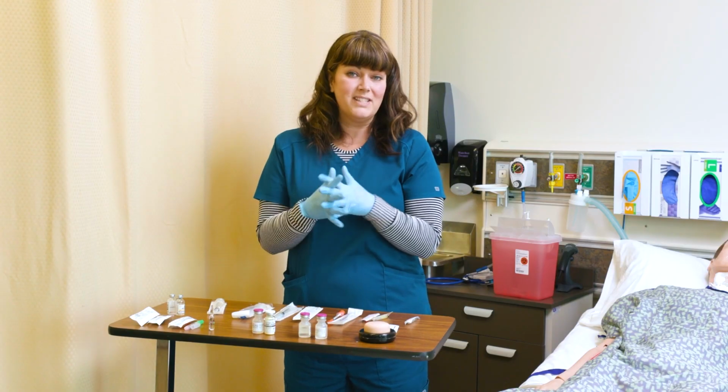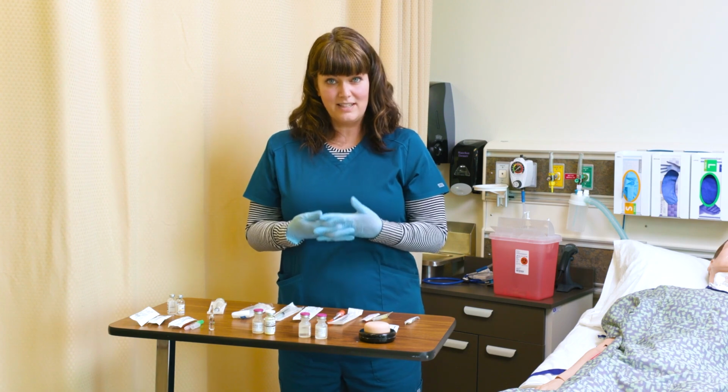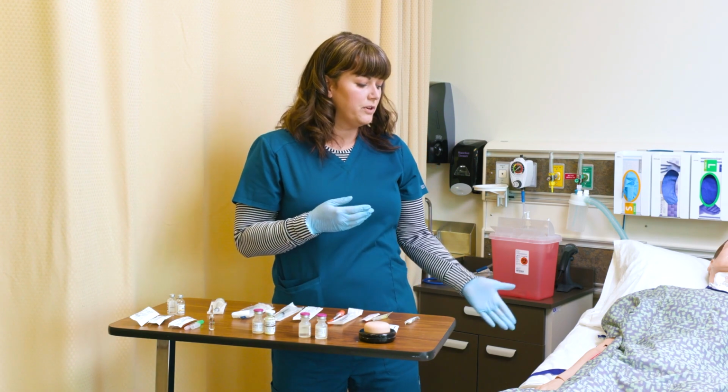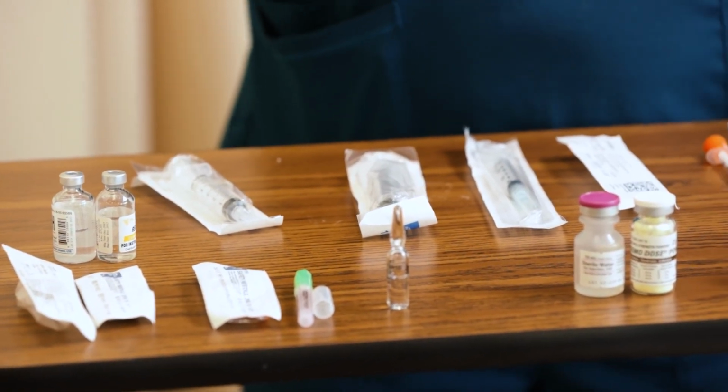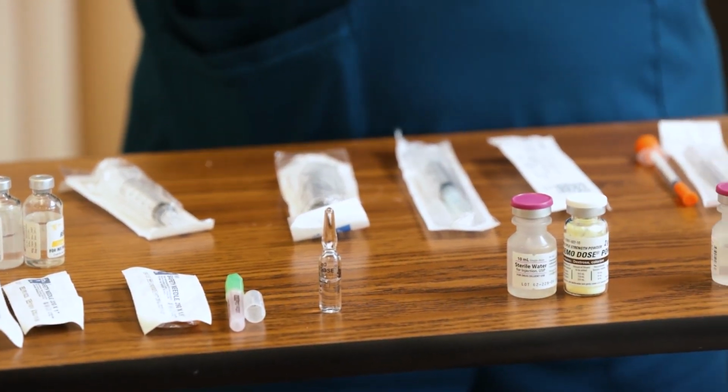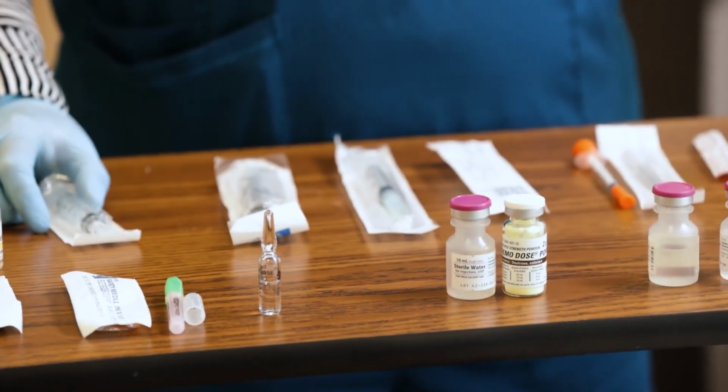First of all is deciding which site you are going to inject in. Now, different sites require different sizes of needles, as do different types of injections. And we're going to talk about that a little bit. We'll demonstrate those for you.